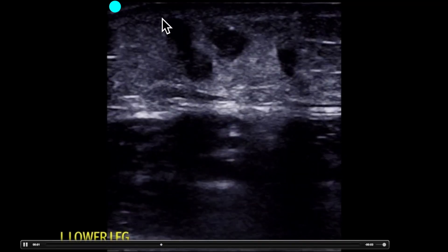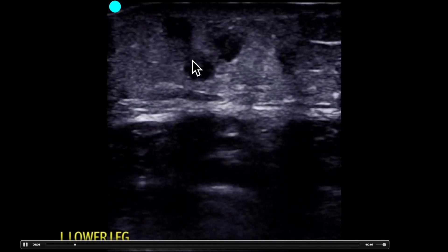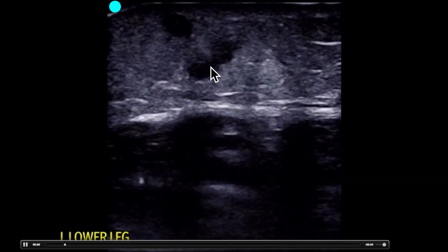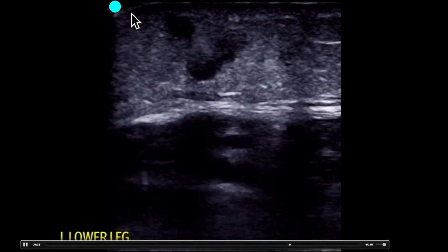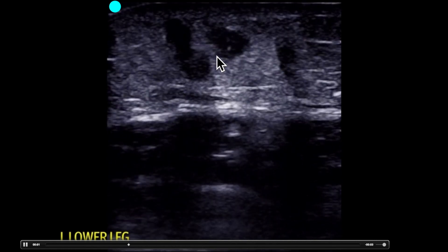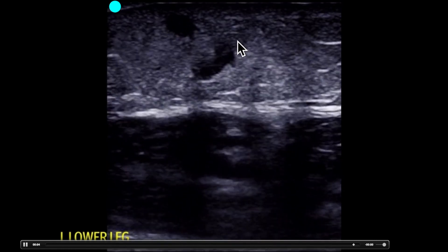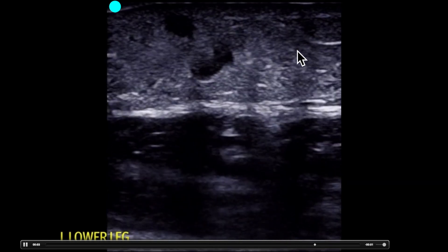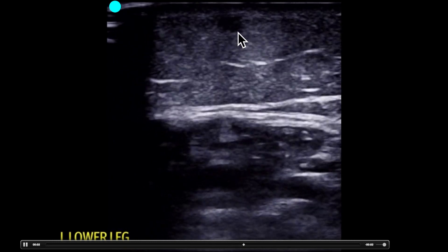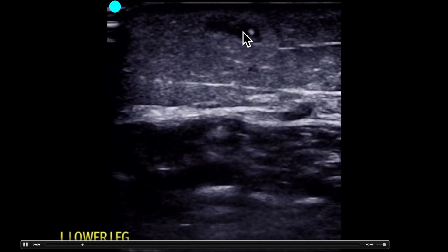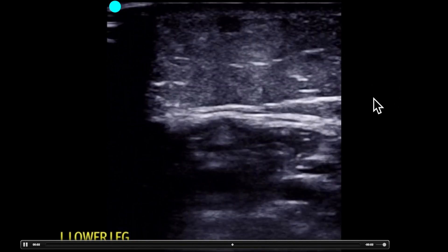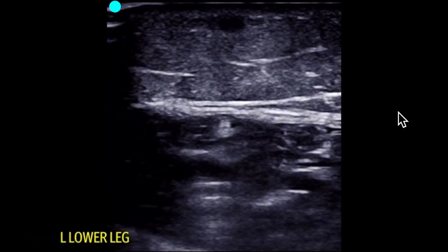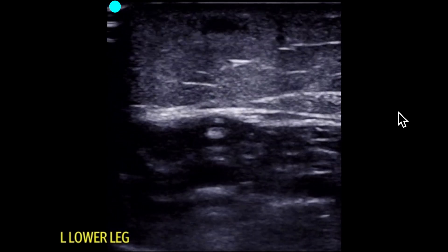We're going to see the confluence of that vein from the previous video come back down and become confluent with the vein here and here, and we can tell as we put compression on this — as the sides shorten — those veins are not winking at us. Following this vein off to the right, we can see that it continues to not collapse, and we can see some suggestion of echoes in there. This is concern for a clot, mostly because it's not collapsing, not because we see echoes — sometimes we may not.